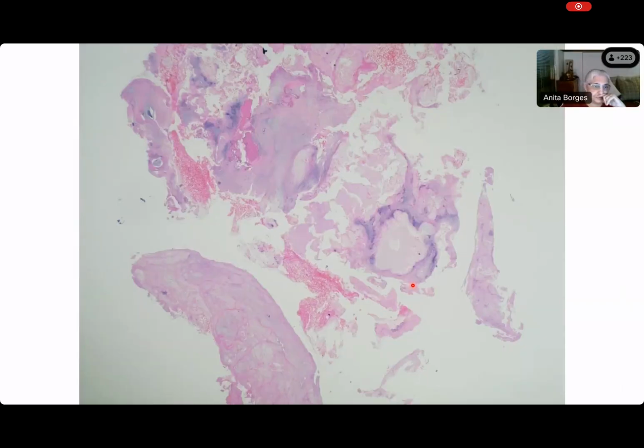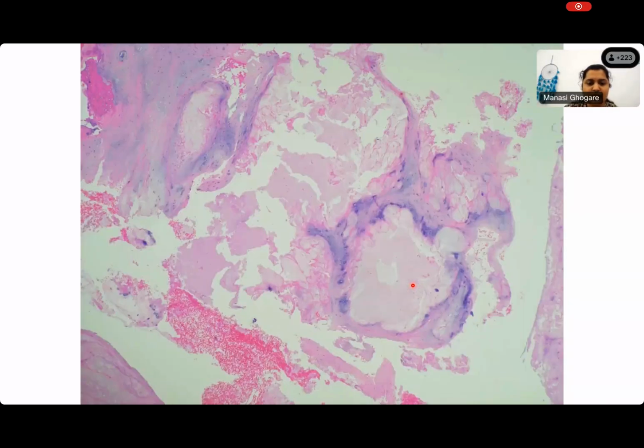You're saying acellular material, but please describe that acellular material, Mansi. Which is homogeneous eosinophilic. At a few places there are chondroid areas. Here it is nodular. You're seeing nodules of what? Nodules of matrix. Can you not describe this? I'm not asking you to even make up your mind as to what it is. You have a description, and that description then leads you to an interpretation. This is true whether you are talking about cells or extracellular material. If you describe it, then you can interpret it.